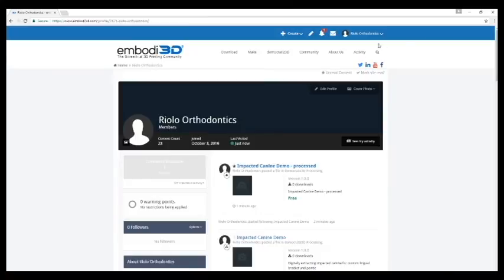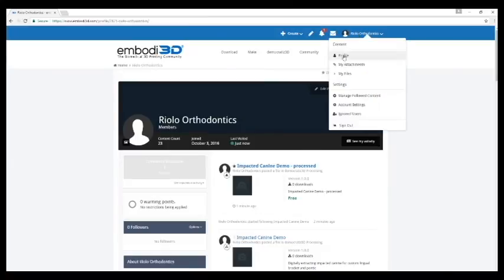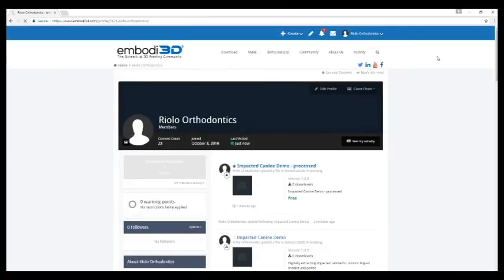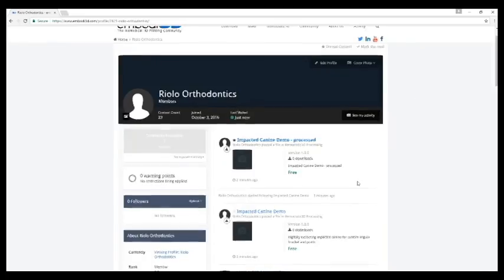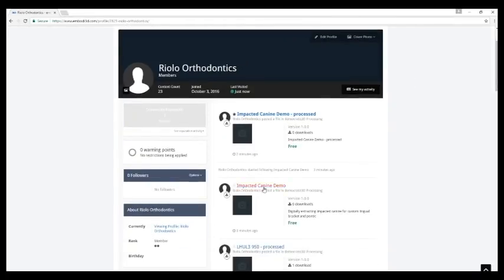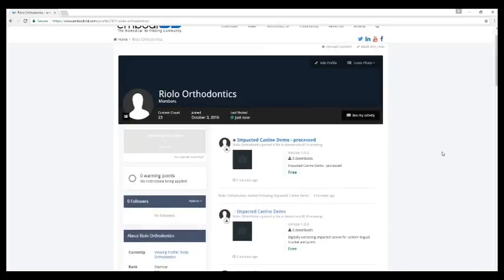So I'm going to go to my profile, refresh, and see here is the impacted canine that we uploaded as an NRRD file. And then in literally two minutes we have our impacted canine back that has been processed.